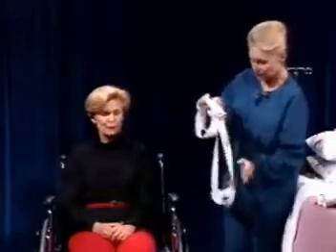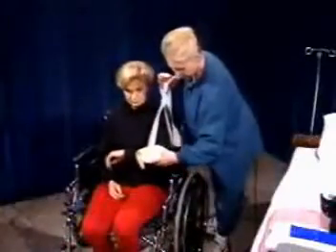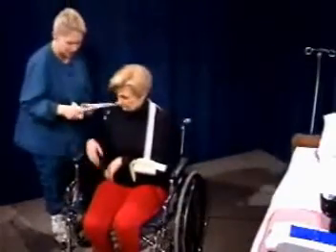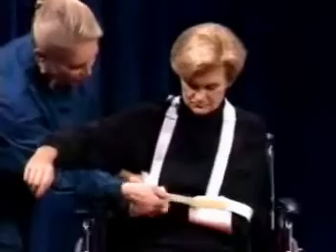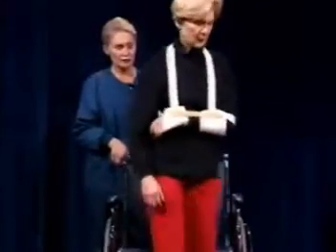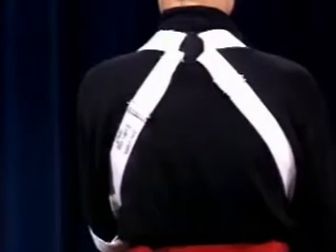I'll show you how that goes on. First of all, there's a cuff area. It has a back strap, and that should be your sign that this is for the elbow. You can go around the back of the patient, one strap in front and one strap in back, and again to the front, one strap in front, one strap in back. The hand is put through, and the wrist and hand are supported, and then a Velcro strap across the two holds it in place. You should always check the back to make sure the straps are positioned appropriately. And now we're going to have our helper stand up and turn around slowly to show you the circle ring position and this proper strap formation for a sling.